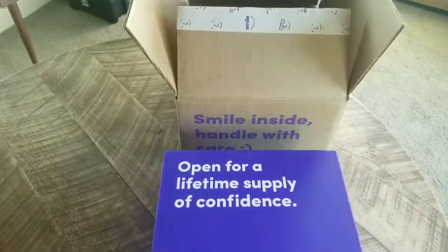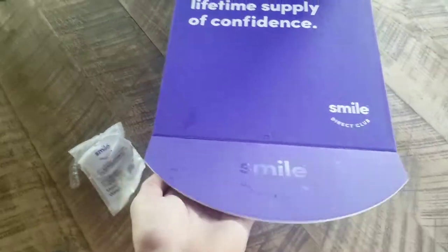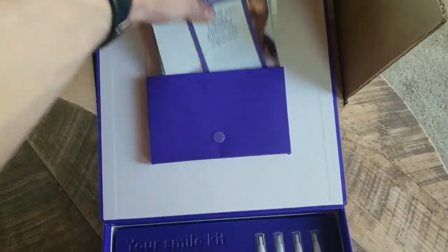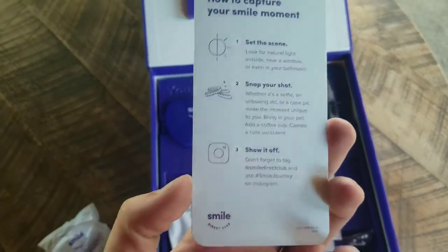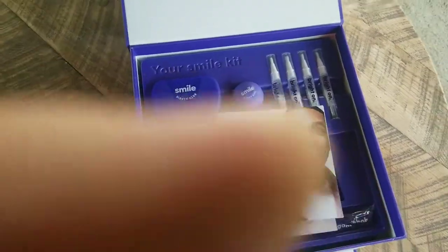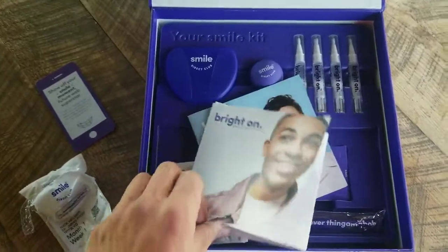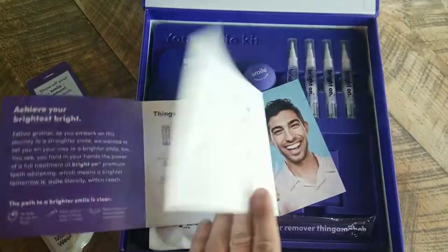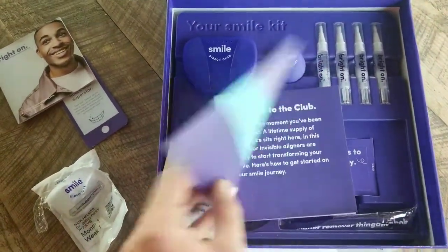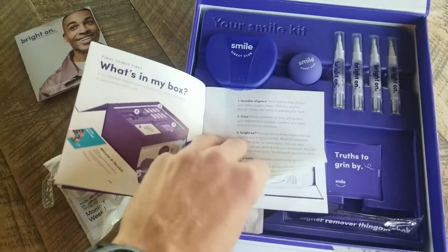So without further ado — it comes in this box, just basic. It actually comes in a pretty nice box that kind of folds open. First you have these little booklets and such. This one is for your Instagram — you know, take a picture, tag them, all that stuff. Sorry, my phone was going off. And then you get a little instructional booklet on your aligner pen or whitening pens — that's all from the invisible aligners — and you get your guide booklet on how to check in and all that.